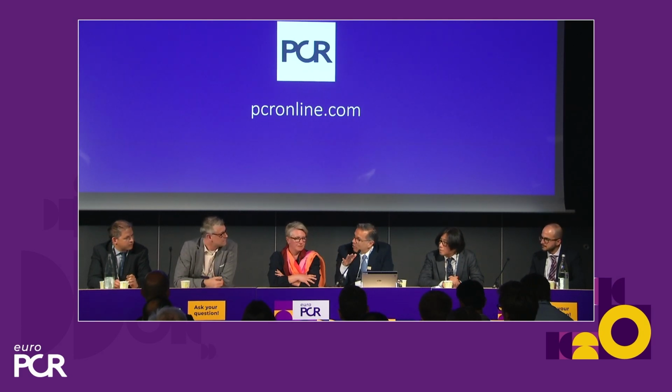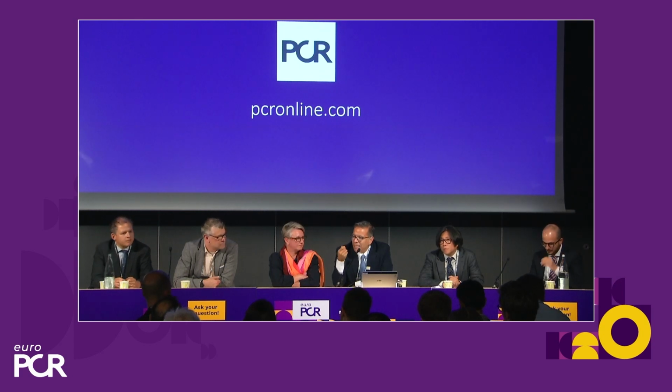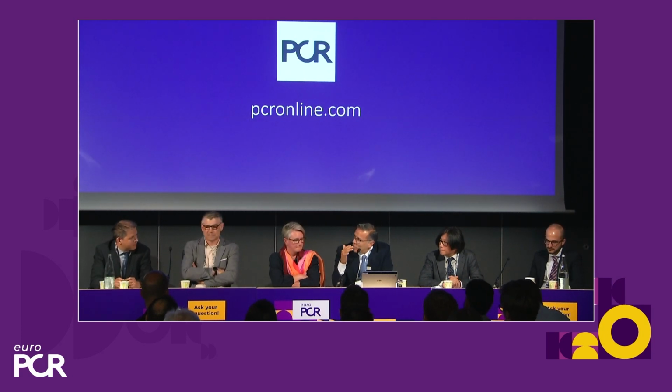We don't want to spoil another technology by doing implantation as we did in the past without any guidance, without any planning. And I think Enrico was showing some nice examples of that. We have to understand that this technology has expansion limits, and it requires proper sizing. So Enrico, the case examples you showed had a very nice correlation between OCT and QFR geometric dimensions for guiding your sizing. How confident do you feel now using QFR 3.1 for implanting Magmaris without OCT?